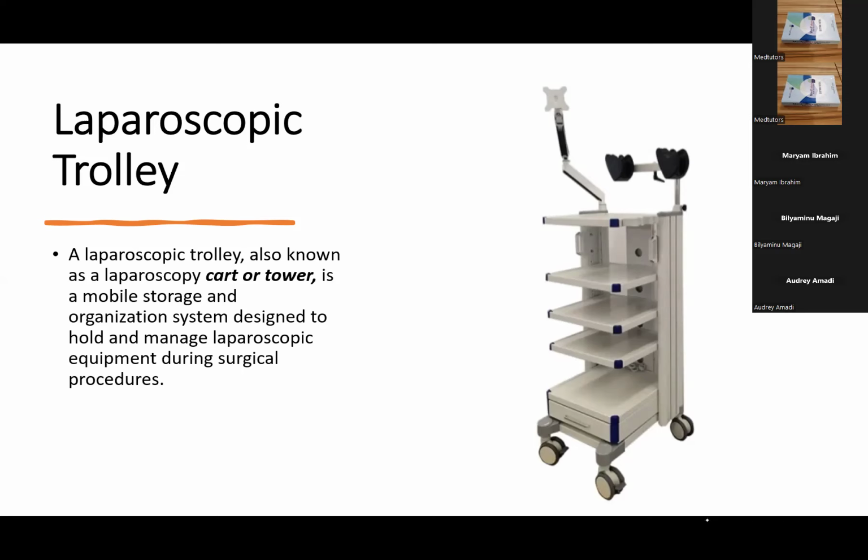On this trolley you have all the equipment, including the power cables. There are sockets installed on this trolley in such a way that there's only one output from the trolley connecting to a main power source. All other equipment are plugged into the sockets that are provided on this trolley.